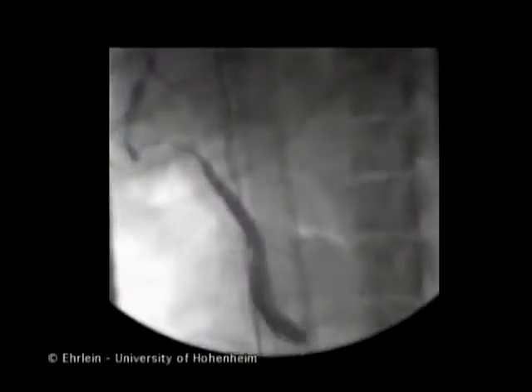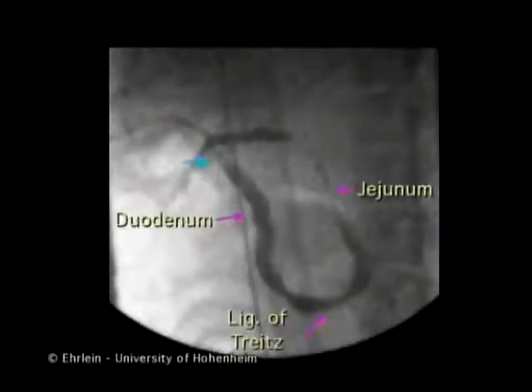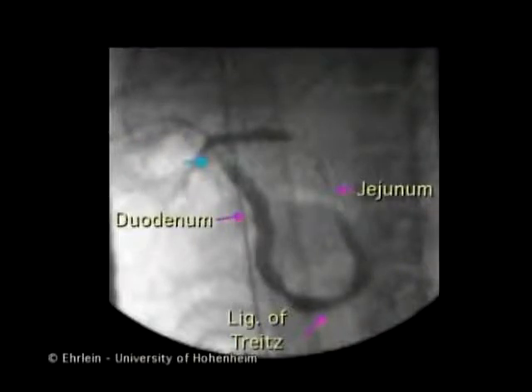The emptied contrast medium is rapidly propelled to the jejunum. We now observe the distal duodenum and proximal jejunum.